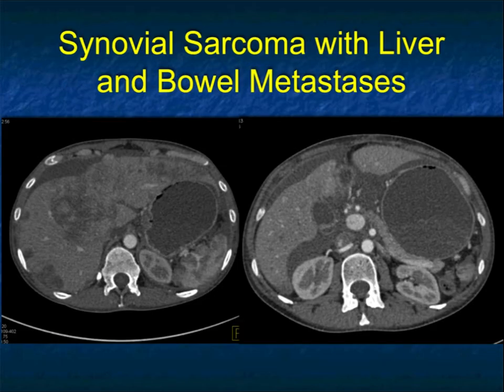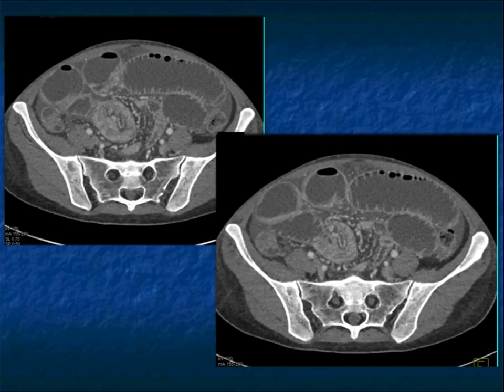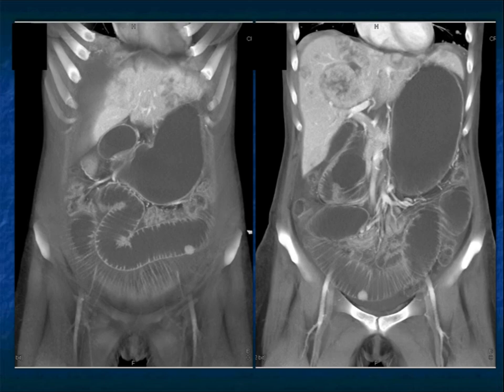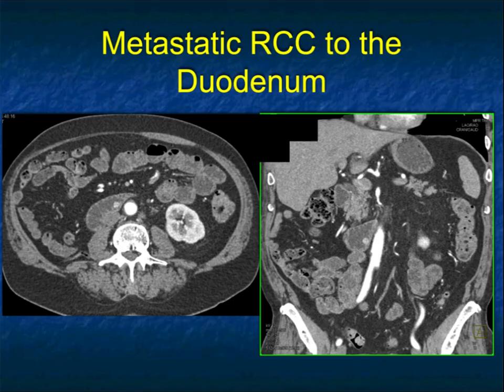A patient with synovial sarcoma had widespread liver METs. Look at the dilated small bowel — the cause is an intussusception right in the patient's right lower quadrant. There are also multiple one centimeter enhancing lesions in the small bowel, all metastatic foci.